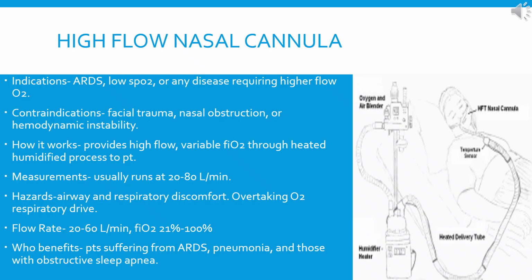Hazards can be airway and respiratory discomfort, overtaking O2 respiratory drive. Flow rates range from 20 to 60 liters per minute, FiO2 21 to 100%. Patients suffering from ARDS, pneumonia, and those with obstructive sleep apnea are who benefit the most.